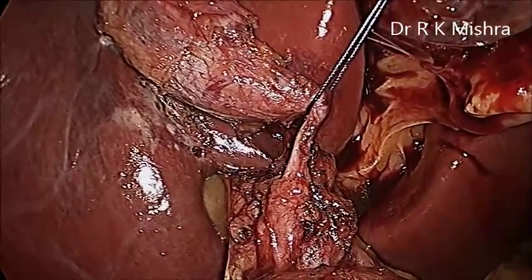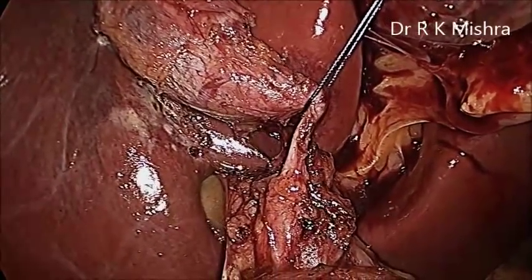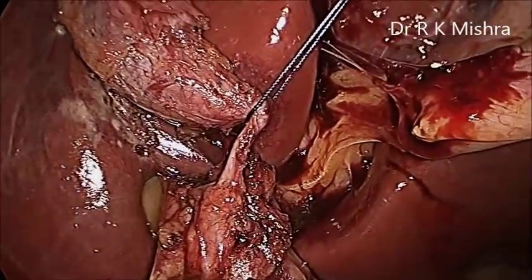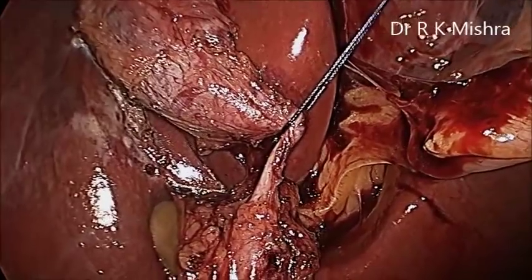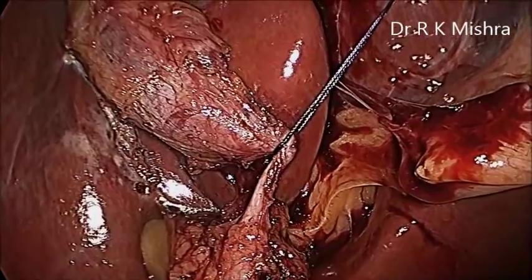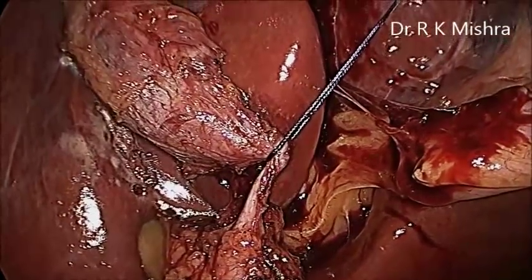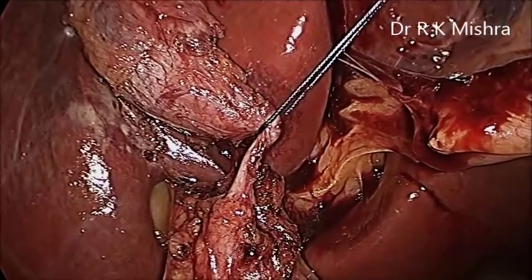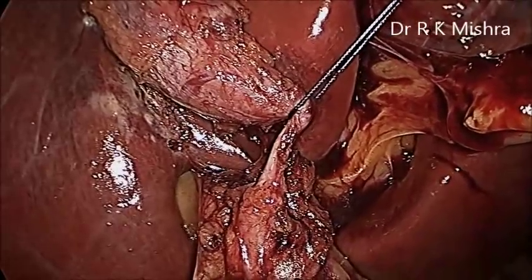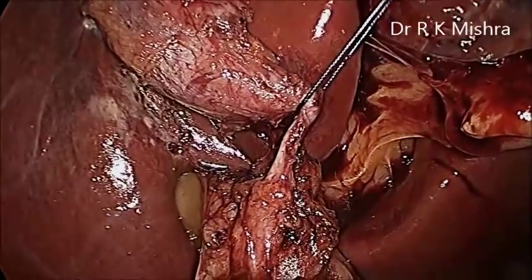Care should be taken that over traction should be avoided, especially for the artery. And now this knot is ready. Of course, it is good because one assistant is holding the finger there over the reducer, so that the vicryl you cannot pull it more. This is the job of the camera person, that he will check that excessive traction is not given when the surgeon is busy tying the knot.